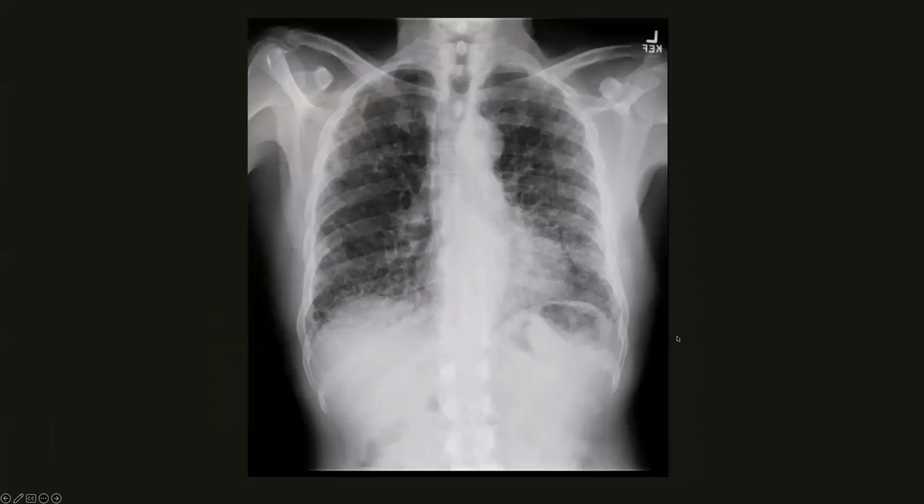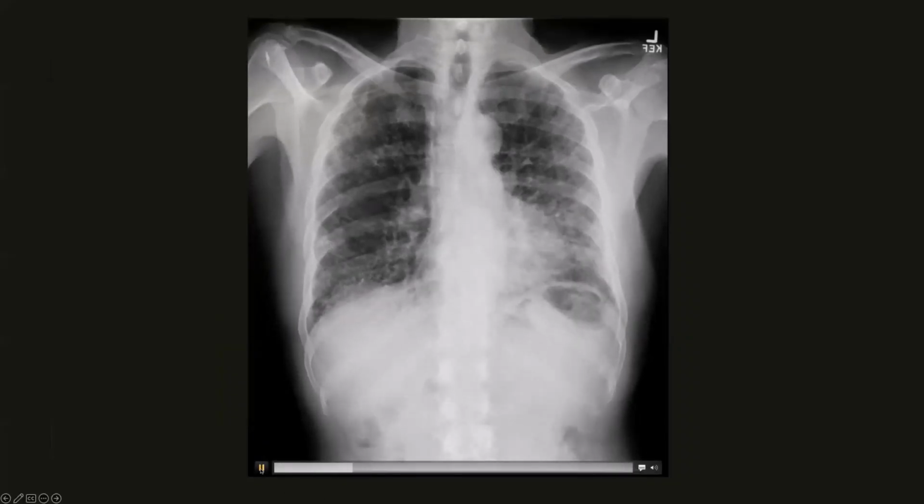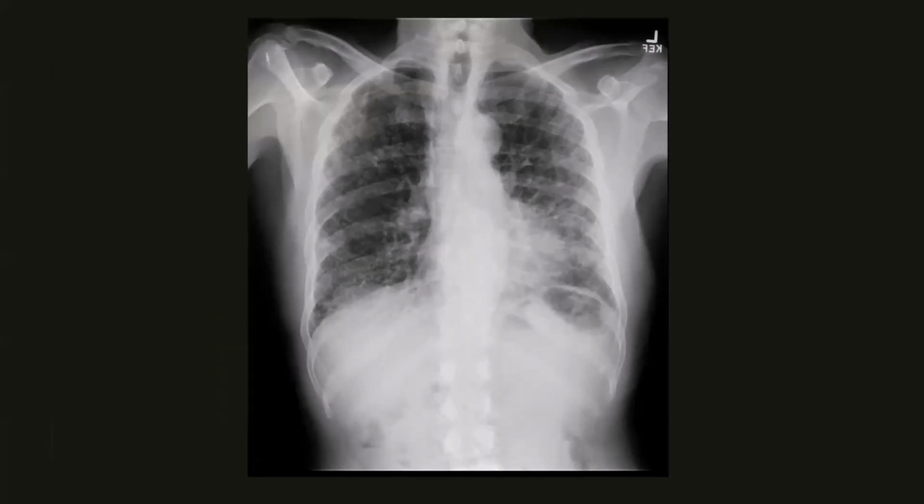At a similar time point, the patient also got this imaging where he was performing a breath hold. So by doing the breath hold, you remove any of the motion associated with respiration. And what the software is able to do is look at each pixel individually and look for changes in attenuation in these pixels. And by doing that, what's being assessed is the pulmonary perfusion, since you've eliminated all of the potential changes that could be going on in the lung parenchyma due to respiratory changes. So this gives you a potential way of assessing pulmonary perfusion to each lung.